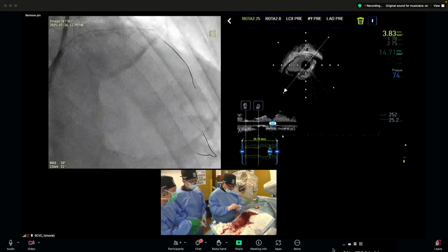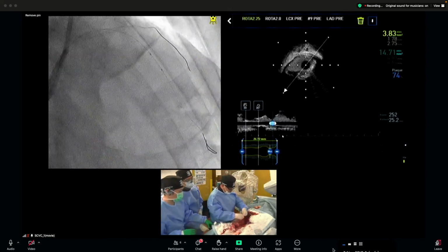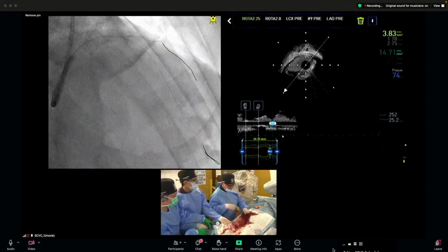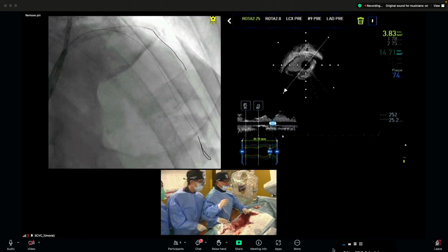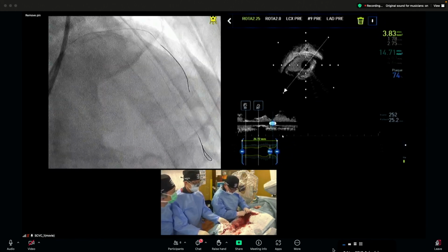Now Kashima sensei performed the side branch dilatation with a 2.0 cutting balloon, and a 3.0 cutting balloon for the kissing balloon technique. So this is after rotablation. Of course, a little bit of spasm happened, but in the end, fine.